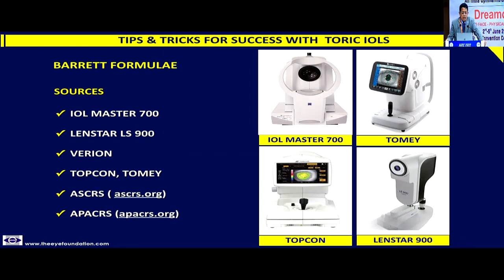As was just asked, I believe that you can go ahead and implant multifocal intraocular lenses as well as torics without the need for this equipment. But if you asked me whether I should invest in upgrading from a medium-level phaco machine to a high-end phaco machine, or invest in an optical biometer, I would say go for an optical biometer. It's not that one particular company's biometer only works. There are several different options in various centers. We have almost all of them, and we find that they give comparable results. So look at the economy, and in case it works for you, please go ahead and invest in an optical biometer. I think it's money well spent.